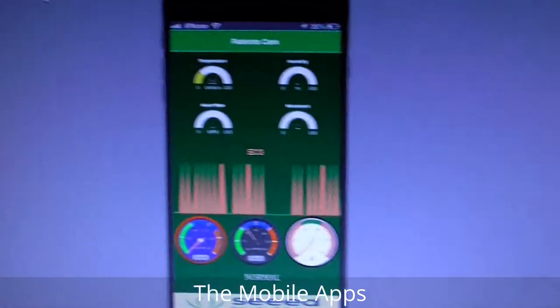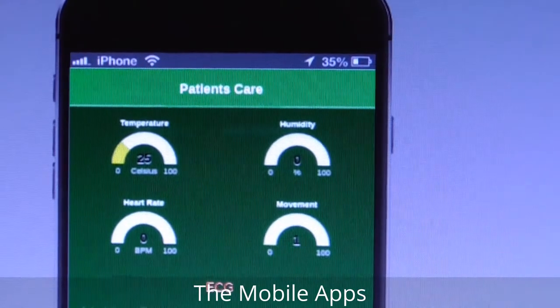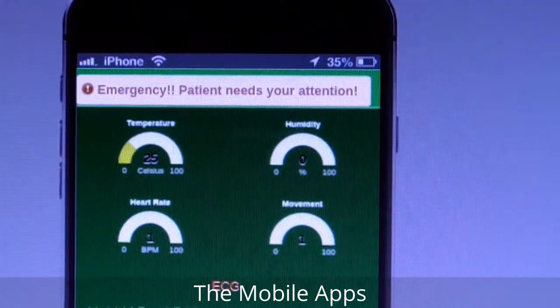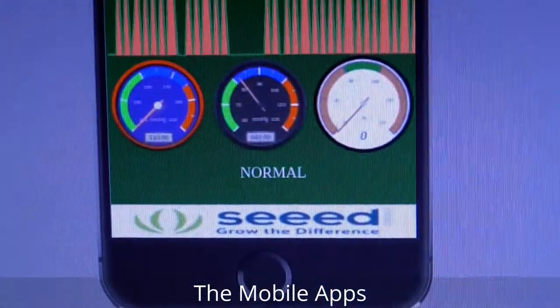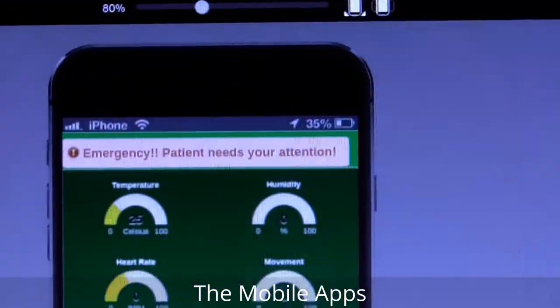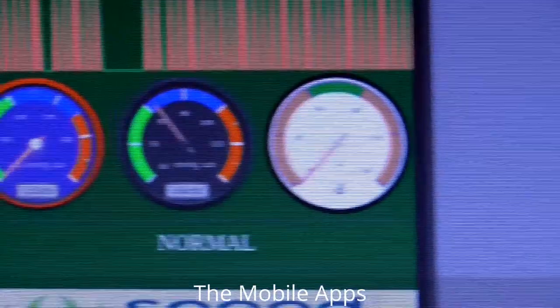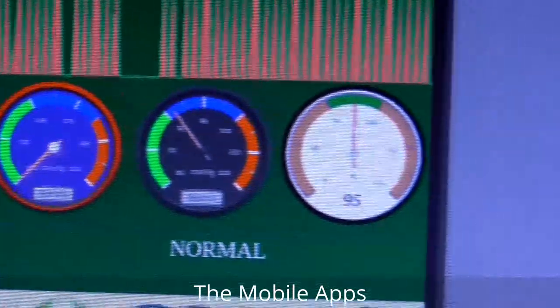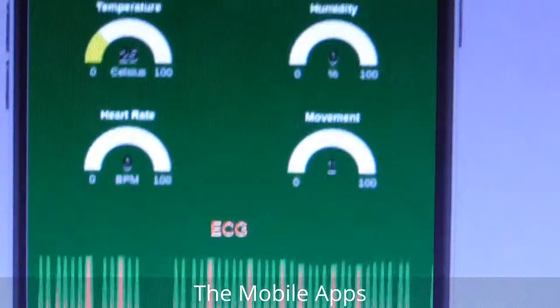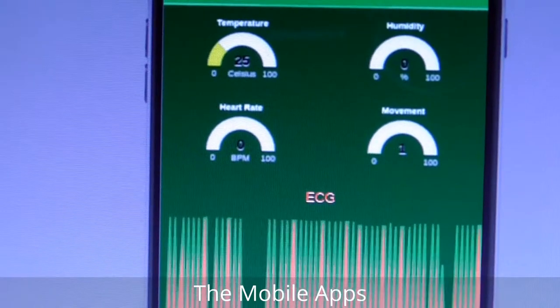Now let's talk about the emergency feature. If an emergency happens, there is a message sent and the emergency light turns on. At this moment I turned off the emergency signal because otherwise it always triggers — since the heart rate is zero, it's always in emergency condition.